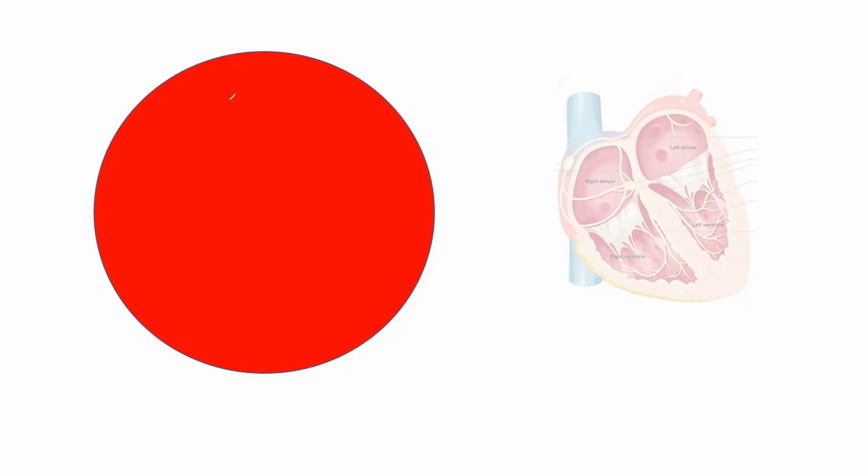In this video, we'll learn how to precisely determine the EKG axis with numbers. The secret for this video is to know how to draw the circle. This red circle, now we add the axes to it, and from there we can determine the accurate axis of the heart with actual numbers.